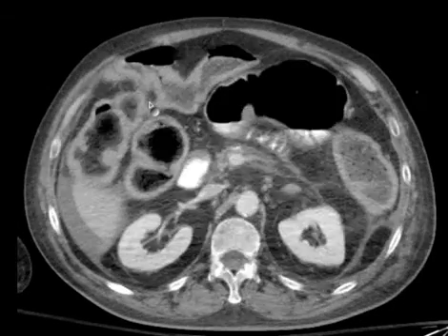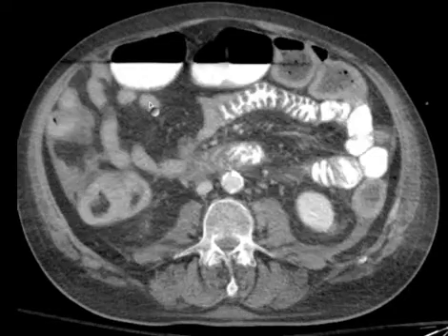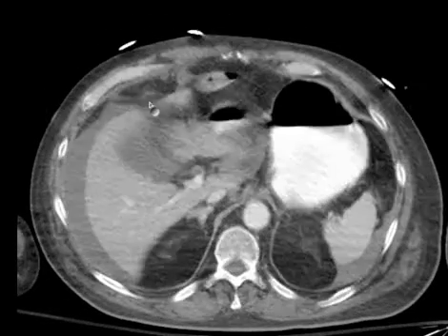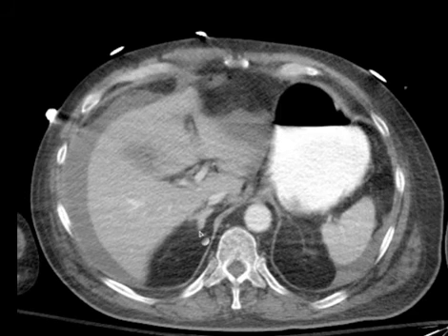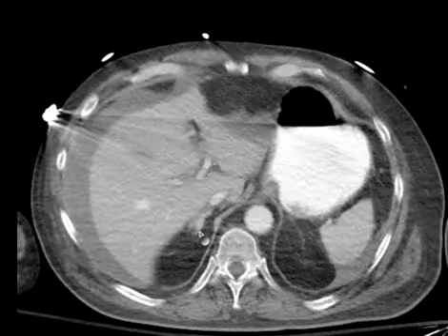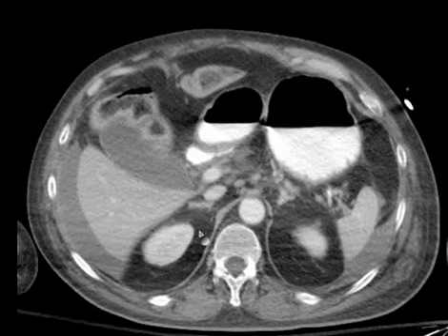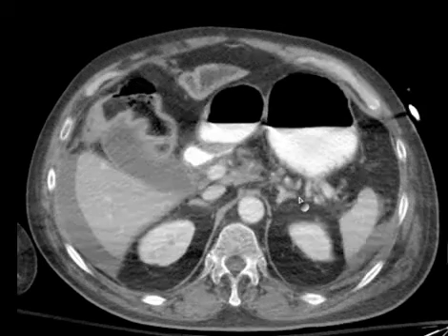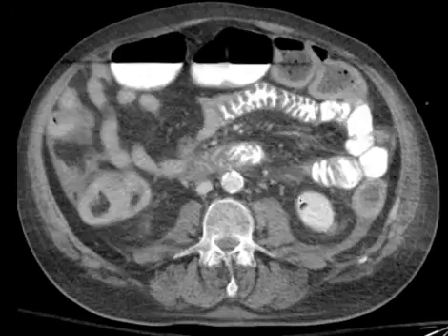Look at the kidneys. The kidneys are enhancing pretty normally — uniform enhancement. That's very important in a trauma case. Always look at those adrenal glands. There's the right adrenal gland. They've always got them here, and even if there's agenesis of one kidney, you will have that adrenal gland there nevertheless.